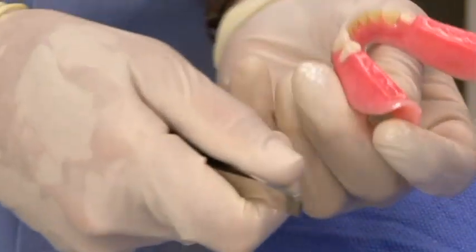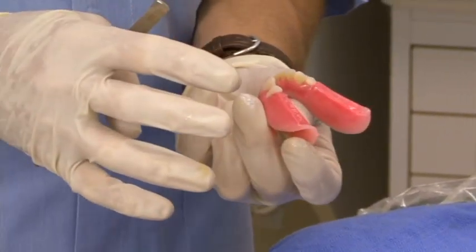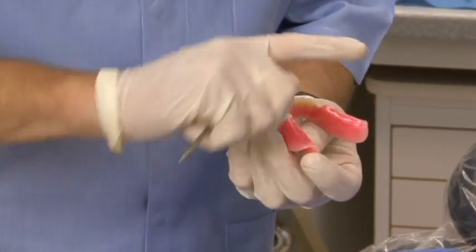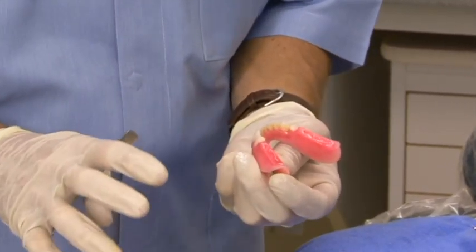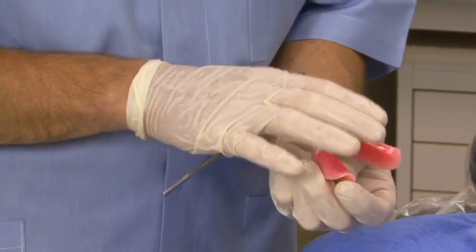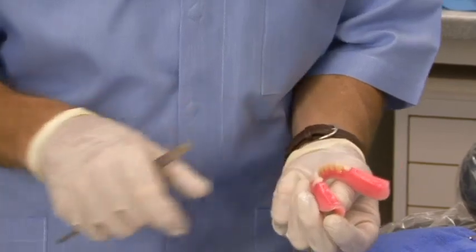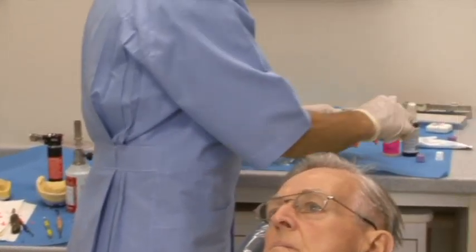If, when you load tested and closed the patient up, you had a huge prematurity and the denture was skating everywhere with the front teeth not coming together right — go ahead and cut the wax down and take another bite record. This is a perfect time to remount, because what the lab is going to use this for is to fabricate the approved provisional denture — the denture that we're going to place Hydrocast in. Now's your chance to verify everything.